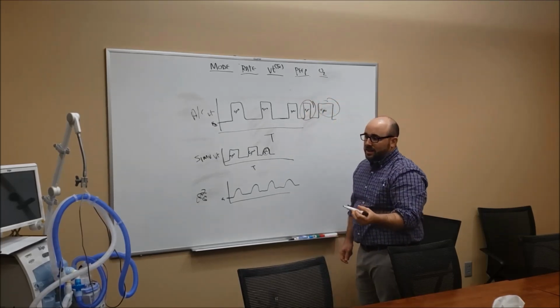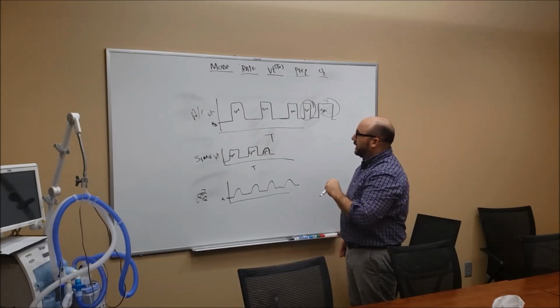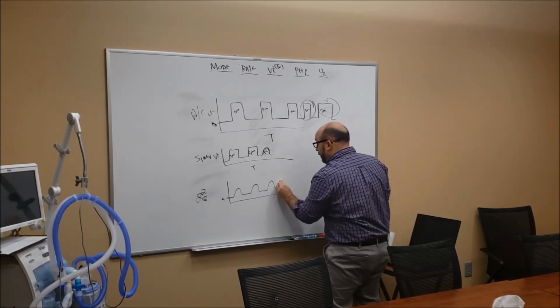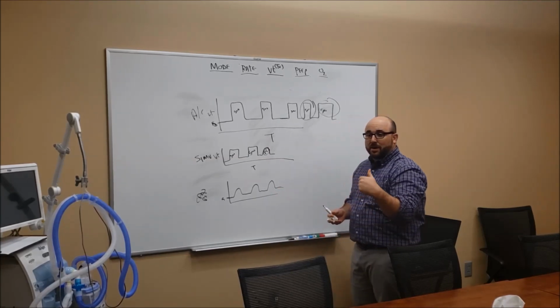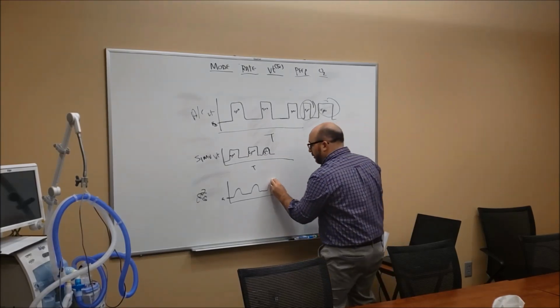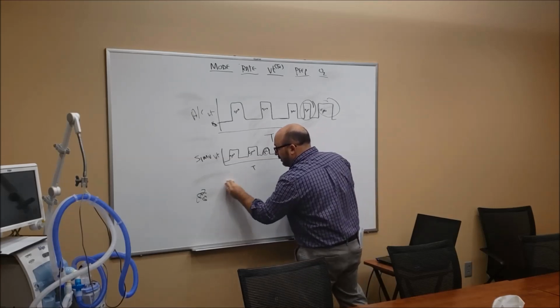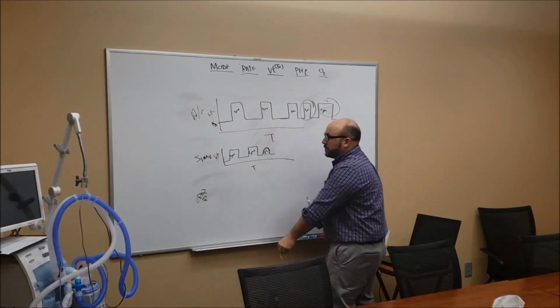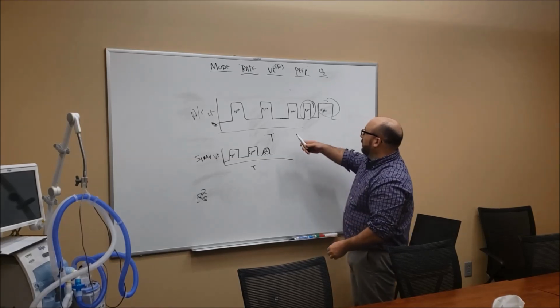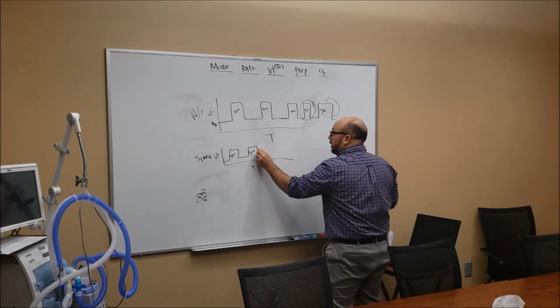500. This is how your patients sometimes down here too, if they're not fully sedated, and they start breathing quickly, they can hyperventilate pretty quick because every time they take a breath, it goes 500, 500, 500. So that's why we really like to have them, if they're in pain or they're not fully sedated, they can get into respiratory alkalosis kind of quick, although those are pretty easy to fix. But every time they get a breath, it's not taking little squatty breaths, they get it finished for them.